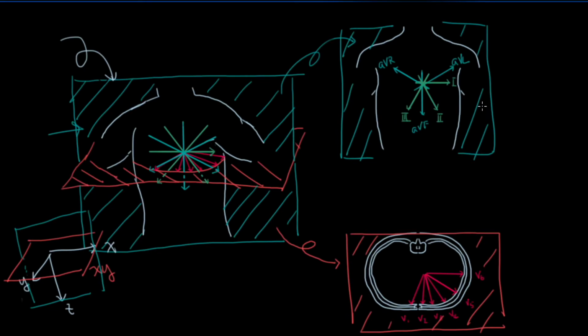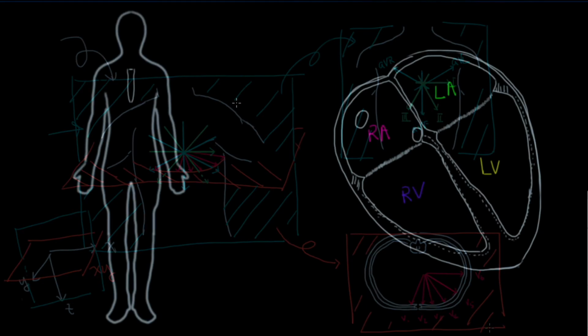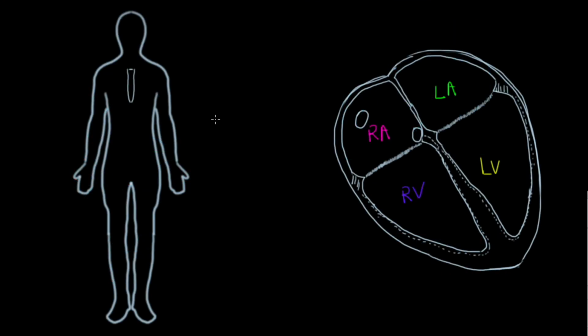And if you parse it down into two-dimensional space, looking at the XZ plane first and then the XY plane, this is how the leads are placed and what the sensors are actually recording. So before we continue onwards, I just wanted to quickly go over why the leads are oriented the way they are. In the previous slide, you saw things going in different directions, and that could be quite confusing. So what we're going to go over is where the leads are and how that correlates with the vectors, the lead directions, that we were having.